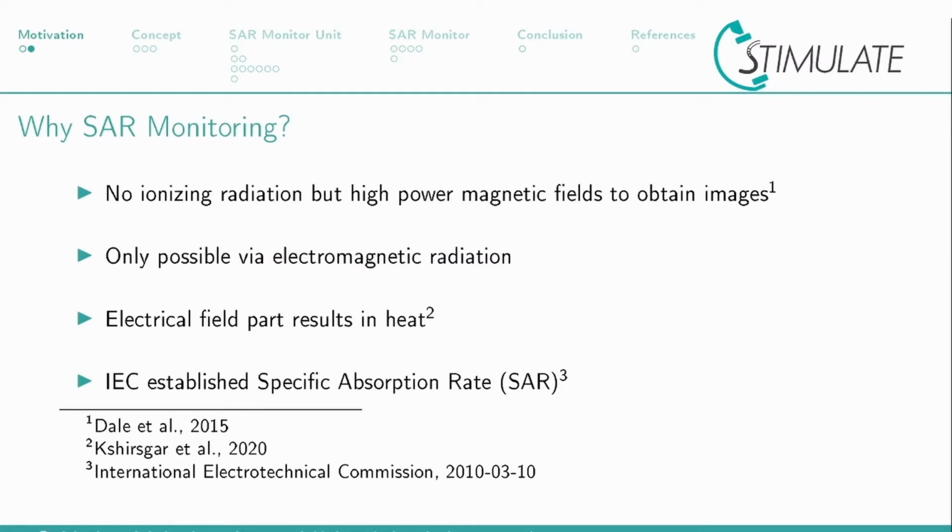The electrical field in the patient can also not be measured directly. Therefore, electromagnetic field simulations can be performed calculating the electrical input power to the transmit coil and the corresponding limits. These electrical input power limits can then be used in a hardware SAR-Monitor, which measures the actual input power and compares it to the limits. If any limit is surpassed, the RF power to the patient is interrupted.